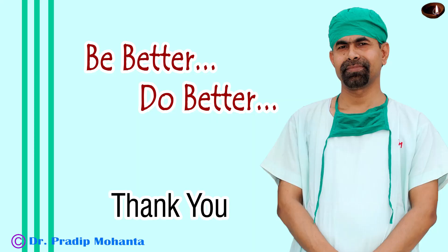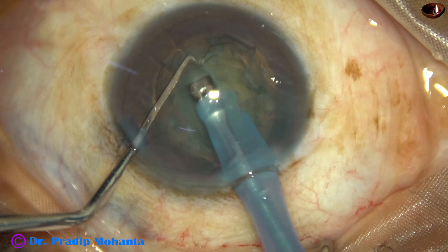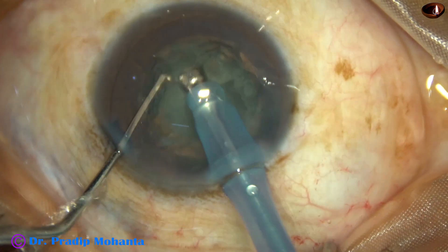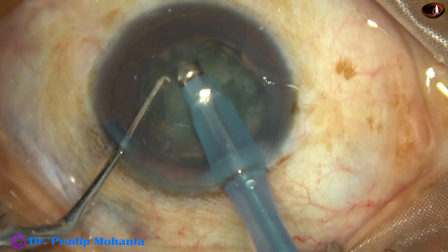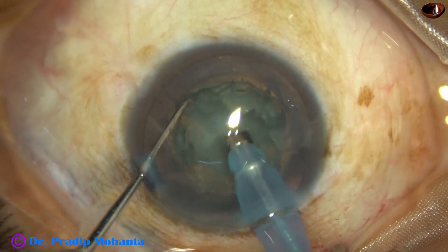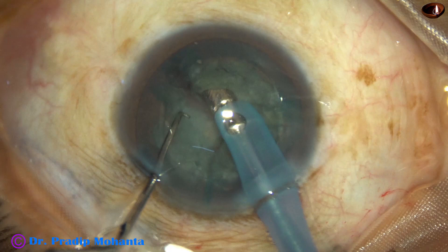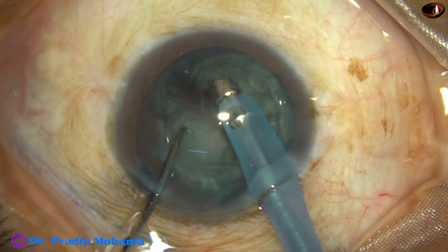Thank you very much for your attention. Hope this video will help you in developing your surgical skills. Whenever we make a trench and find that the nucleus is not equally divided, we can make another trench from the initial trench onto the bigger half of the nucleus and the trench becomes like a T. We can divide the nucleus into three pieces and manage the case.